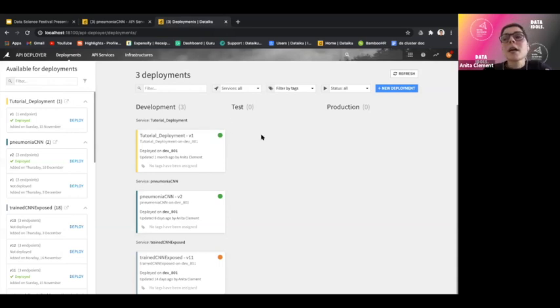So the API deployer is some kind of centralized UI where you can manage your fleet of API nodes. That's also where you can deploy new services and monitor the health of your API models. So you can really do many things, but basically your nodes and also your API services. It's a management sub-platform, I would say. And here is already my API service for these pneumonia predictions. It contains different endpoints, but the main one, as I said, is the prediction one.